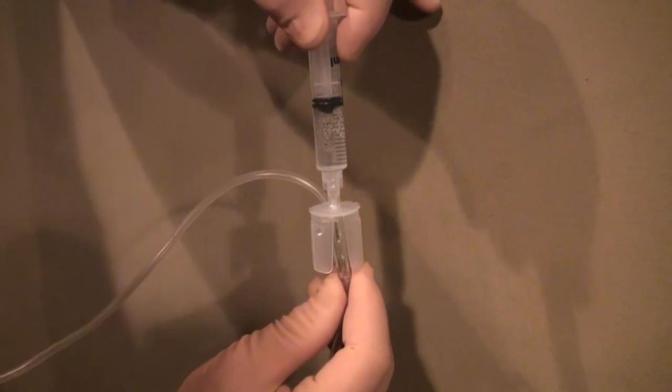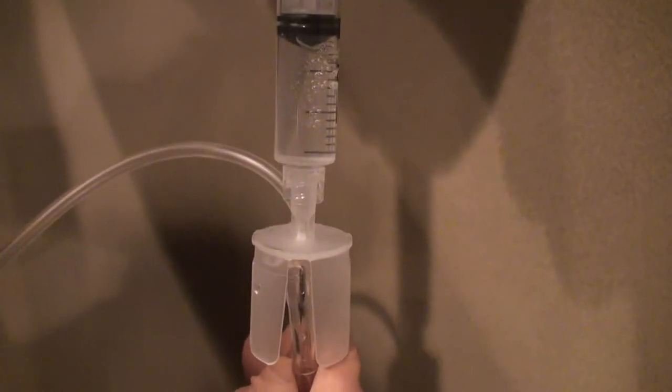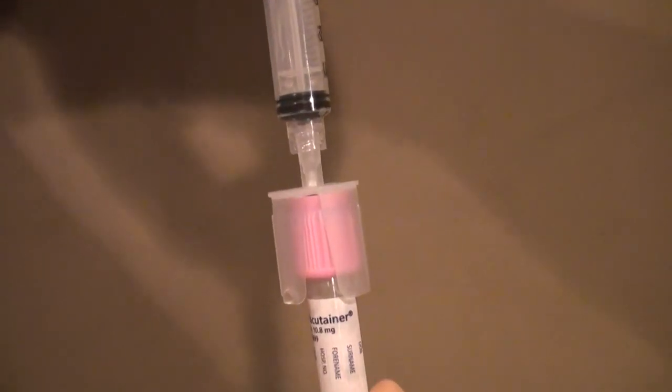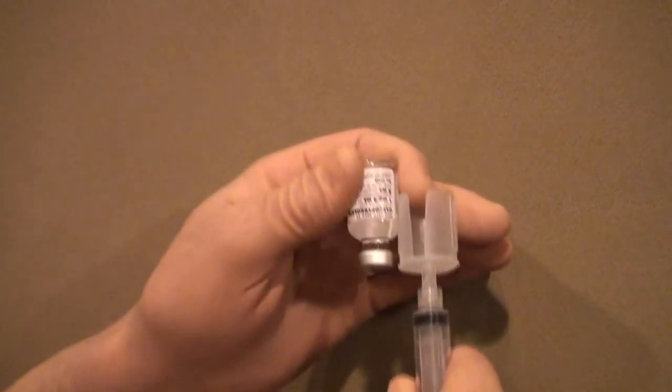MedMate's unique design allows for easy injection into IV ports. And with MedMate, a needle misalignment will not lead to a needle stick. MedMate easily clicks onto specimen tubes for easy specimen transfer. Accidental misalignment does not lead to a needle stick because the protective guards keep the needle away from the fingers.